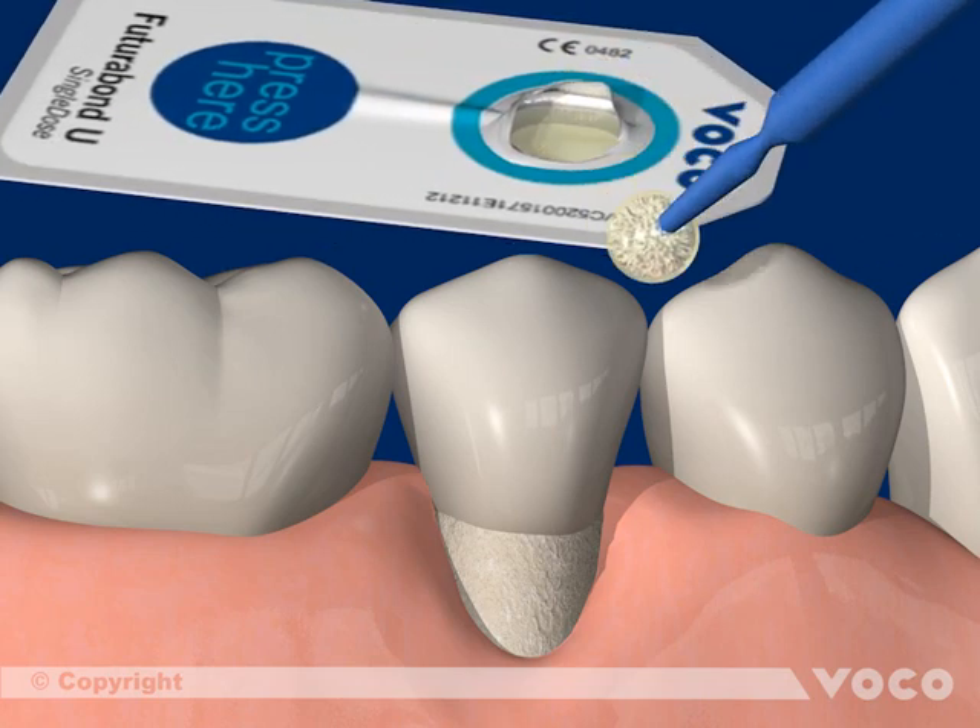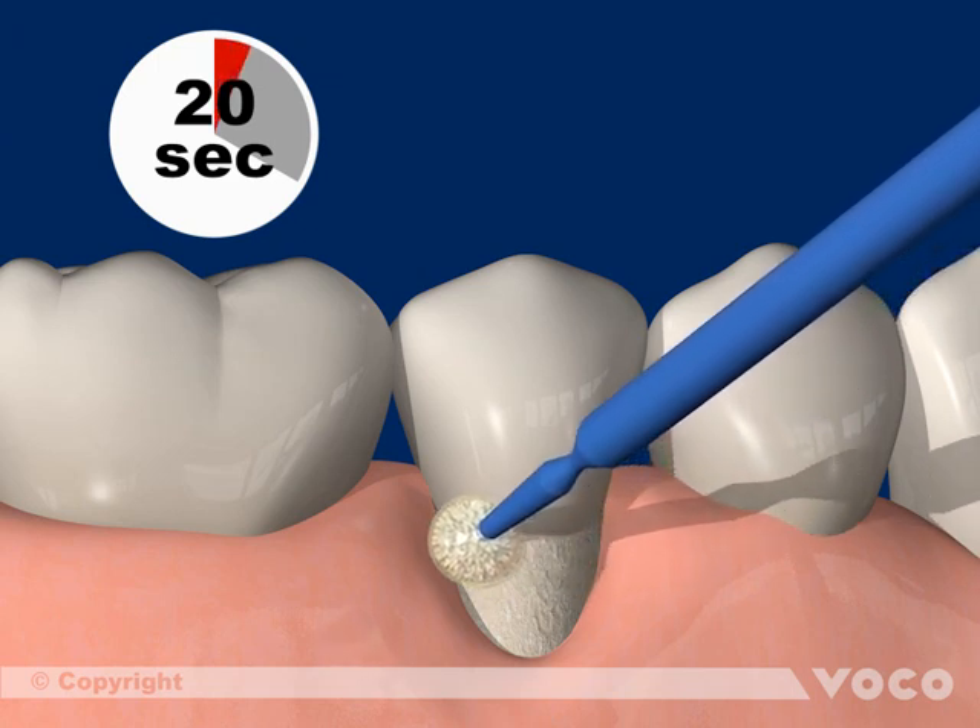The exposed tooth neck is completely covered with Futura Bond U, which is then rubbed in for 20 seconds.